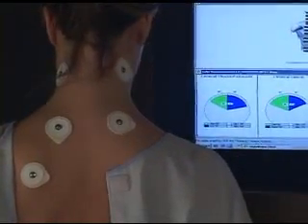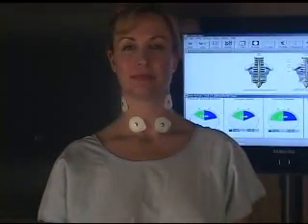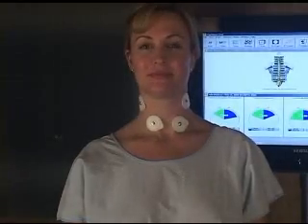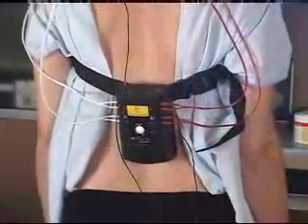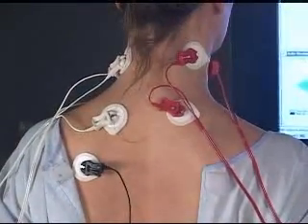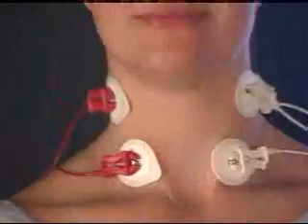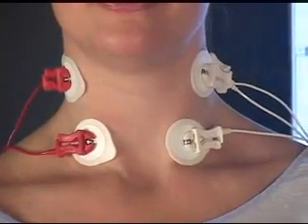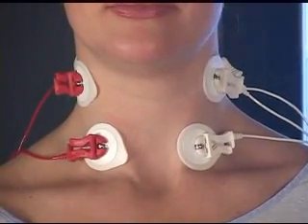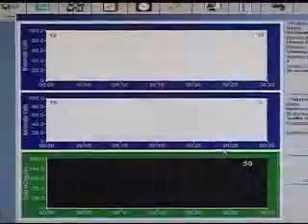The next thing we do is we put on the SCMs. With the SCMs, we attach electrodes, as you can see there. And again, that becomes channel 3 and 4. Left is white, red is right. And here you can see the dynamic probe. We place the device on the body, and you can see how we have the electrodes. You can have the electrodes rotated a little bit so that the lead wires are not tugging on the patient. You can see there how they're placed so they're not tugging on the patient. Those are the SCMs approximately. Have the doctor choose where he wants to place them.